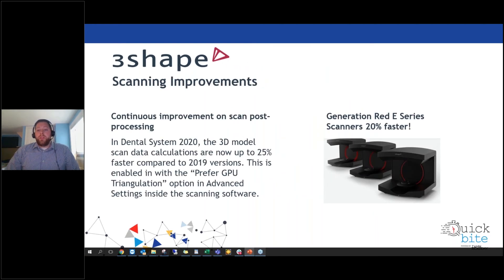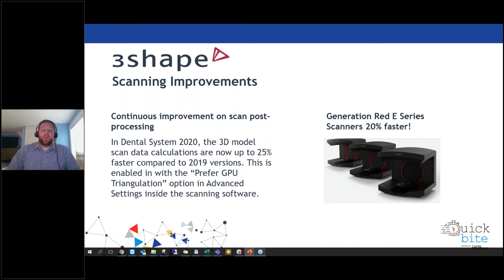Starting with scanning improvements: with the 2020 version, 3Shape increased the computing calculations of the proprietary triangulation of the point cloud. They increased the effectiveness of calculation times while maintaining individual accuracy and scan information. This was enabled by increasing the correlation between the software and the GPU — an integration between the scanner hardware, software computations, and the computer hardware — all three leading to increased scanning effectiveness.